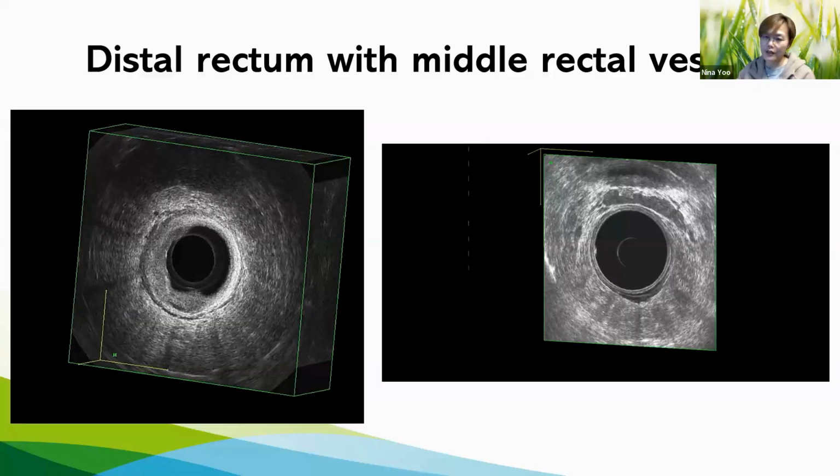Other companies like GE or Samsung don't have a 3D system yet, unfortunately. But with a 2D system, you can actually make these images. The only problem is they don't have the continuous ring probe, because the 3D reconstruction is available only in the BK system.